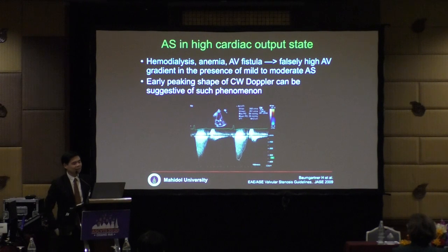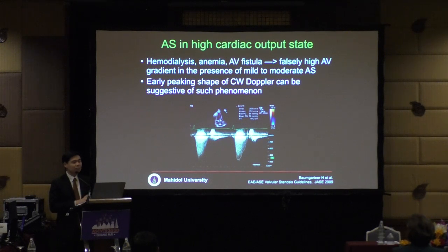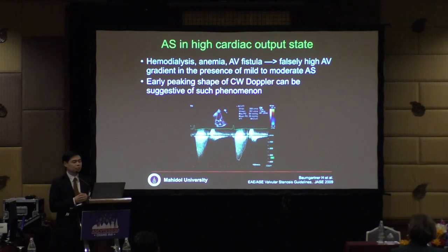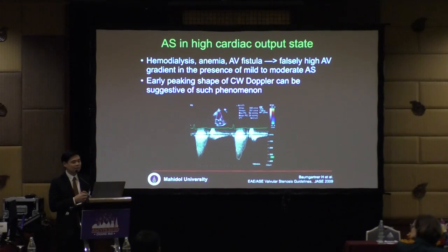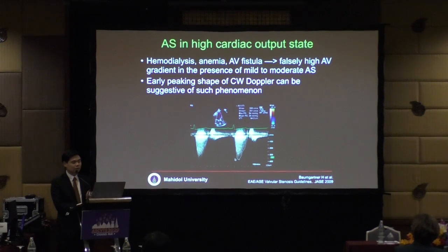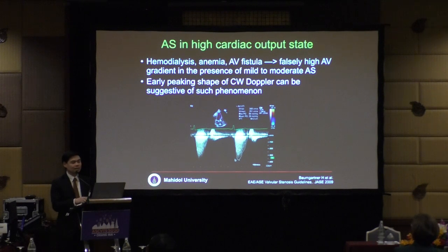This is AS in the high cardiac output state — settings include hemodialysis, anemia, or AV fistula, which can cause falsely high AV gradient in the presence of mild to moderate aortic stenosis. A hint is the shape of the CW Doppler: a very early-peaking shape can be suggestive of this phenomenon.